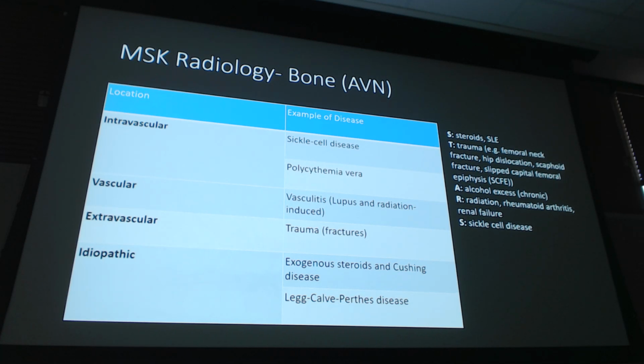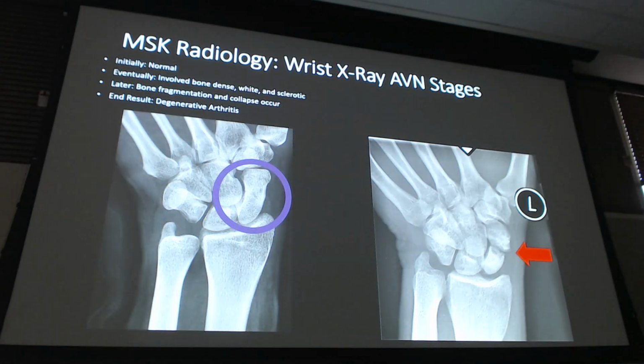And that's what really makes it jump out more when you're looking for it, that increase of bone density. So we talked a little bit about the femoral head last time, right, and kind of what that looks like. Yes, that can happen, but it's more common in the scaphoid than it is in the femoral head, okay? It can happen in the femoral head. Those are the 2 most common places. But the odds are in your career, if you catch this, it's going to be this scaphoid bone, okay?